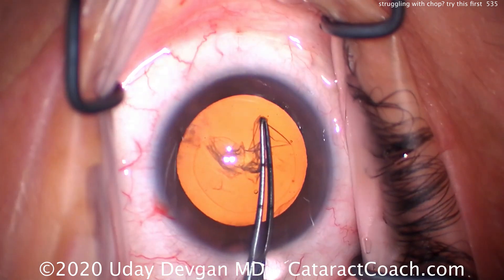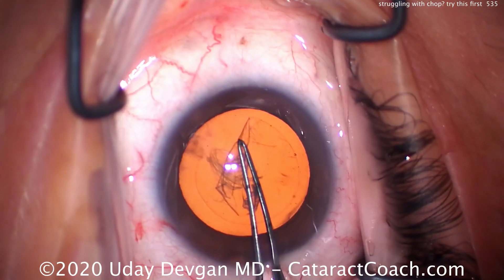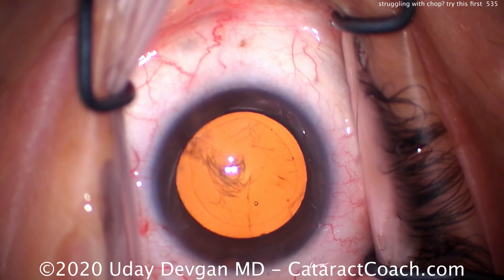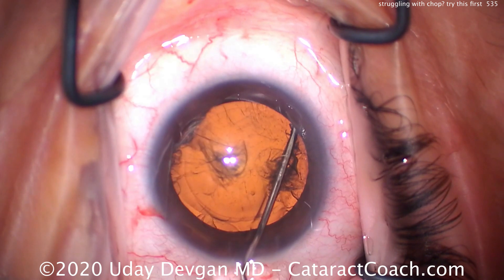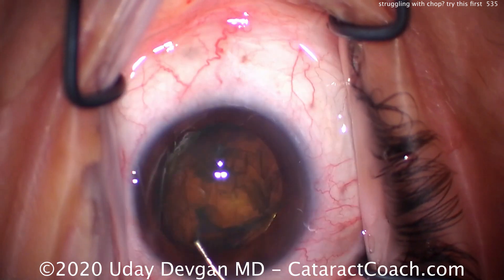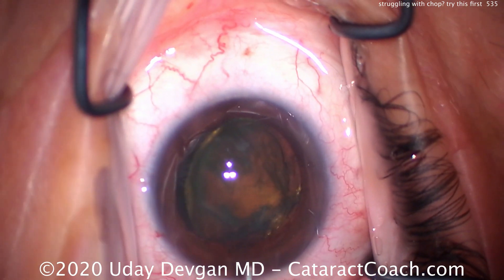Doing a nice capsulorrhexis here. Key in this case: let's have a five or five-and-a-half millimeter capsulorrhexis — we cannot have a baby-sized capsulorrhexis in this case. That looks beautiful. We're going to do flip and chop — we're going to get the nucleus out of the capsular bag. Here's our hydrodissection; good fluid wave going across. There's the nucleus coming up, and now we've got a good lift of the nucleus.